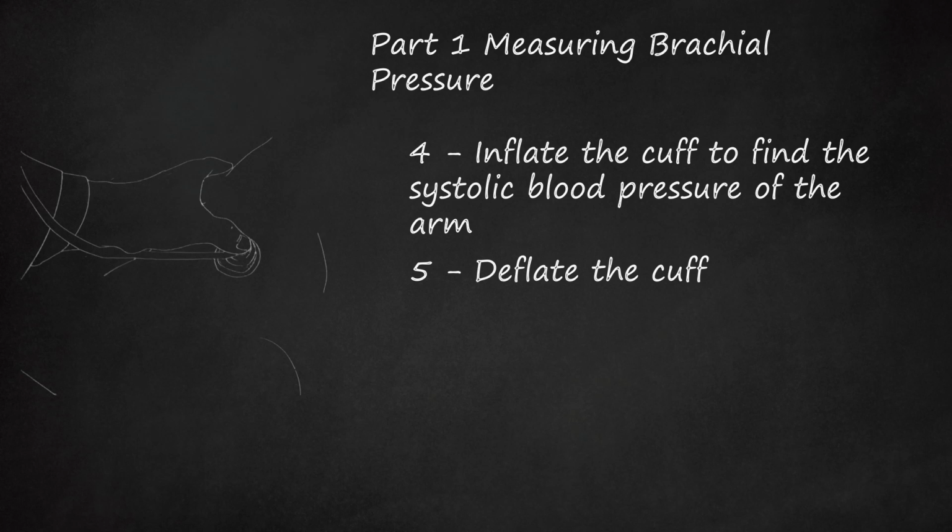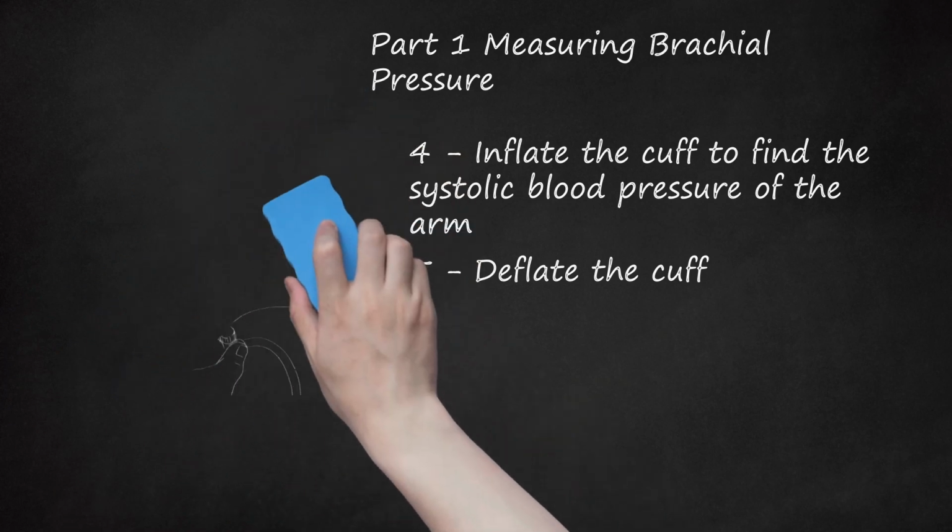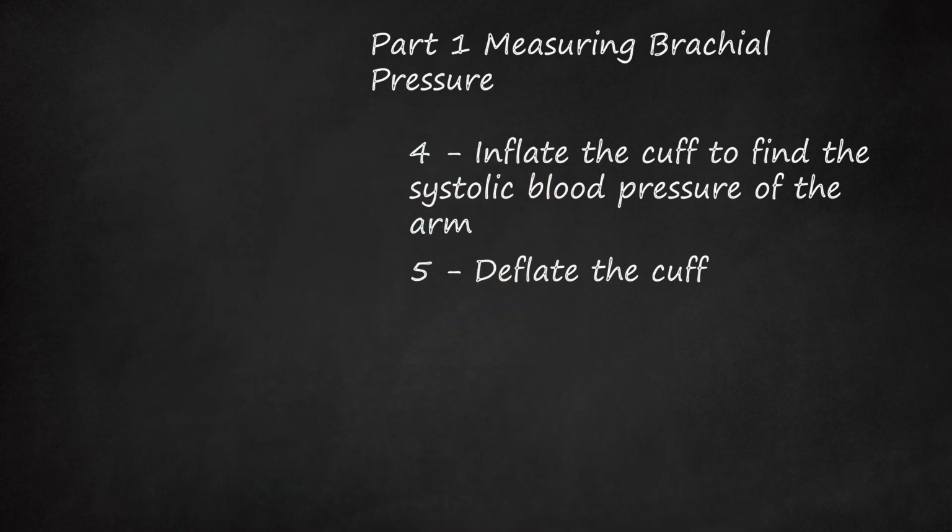5. Deflate the cuff. Release the pressure slowly at a rate of 2 to 3 mm of mercury by opening the valve while closely monitoring the manometer, the pressure gauge. Take note when the pulsating sound returns, and again when it disappears. The systolic blood pressure is the point where the pulsating sound returns and the diastolic blood pressure is when the pulsating sound disappears. The systolic blood pressure is the value you will use later to calculate the ABI.